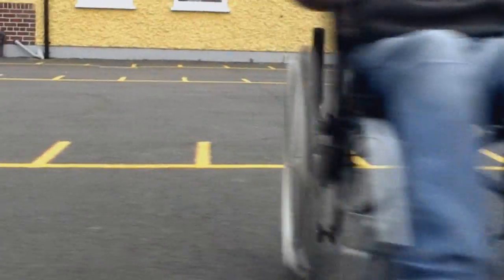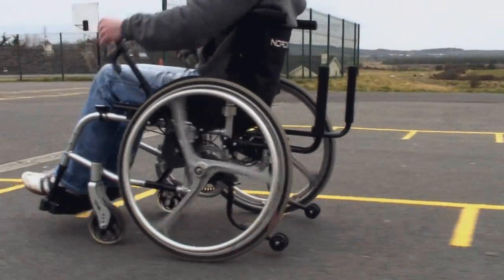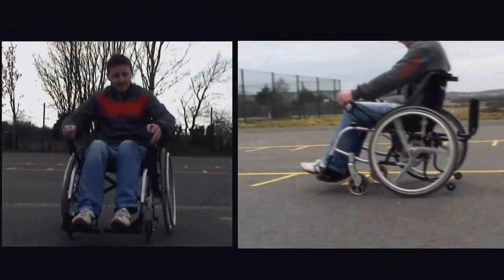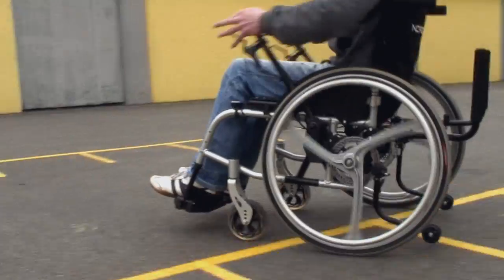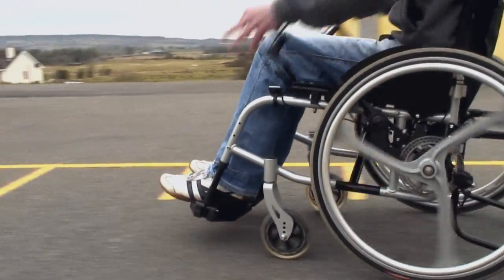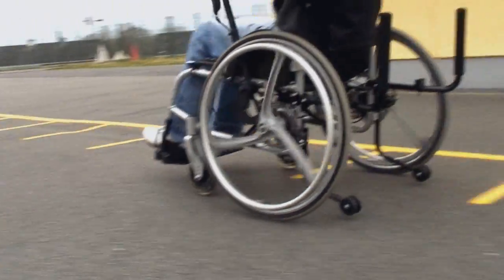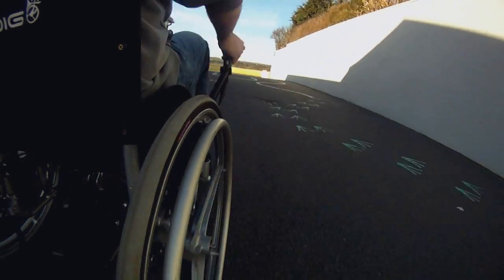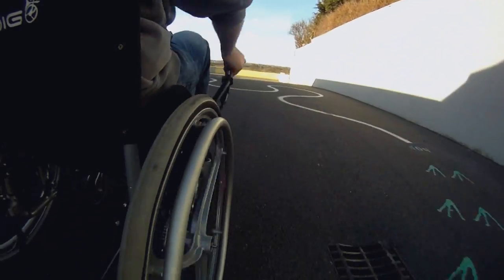The Nordigo changes all that by changing the user position and allowing them to use not just their arm muscles, but their much larger chest and back muscles. This one change, along with the fulcrum effect of the levers, allows the wheelchair user to use the power they had all along but could never take advantage of. The Nordigo further increases the effect with clever gearing for a dramatic improvement.